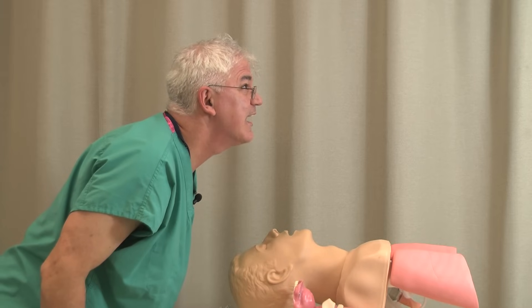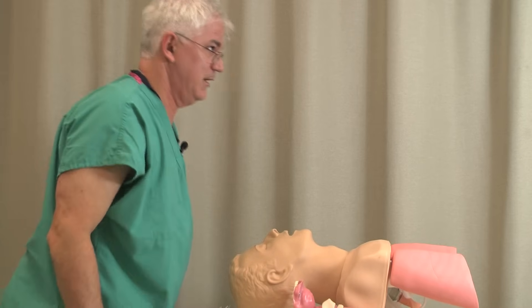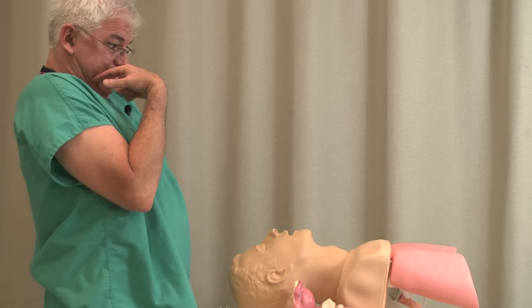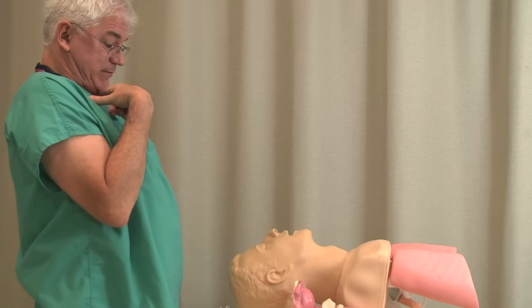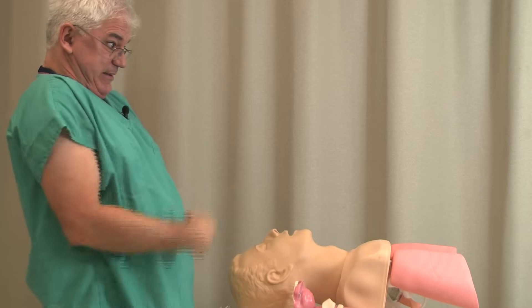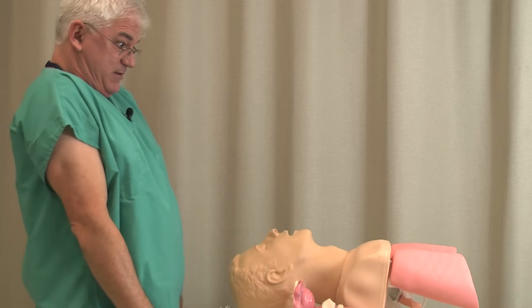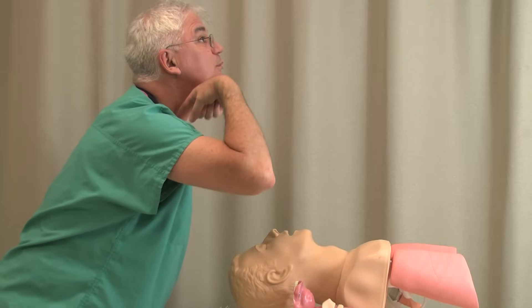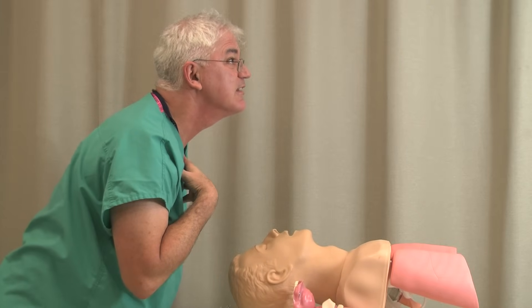I'm going to do the exact opposite. What happens if I put my head back like this? There's just no way — in addition to having many double chins here, there's no way I'm going to get in this way. This is the worst possible position. This gives me the best possible position — that's what you want in the sniffing position.